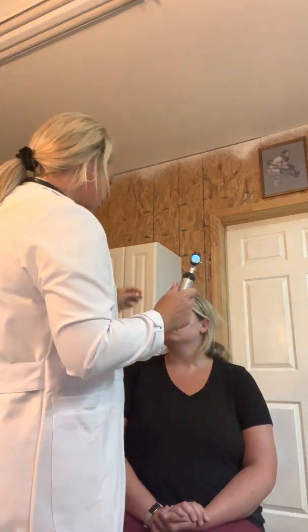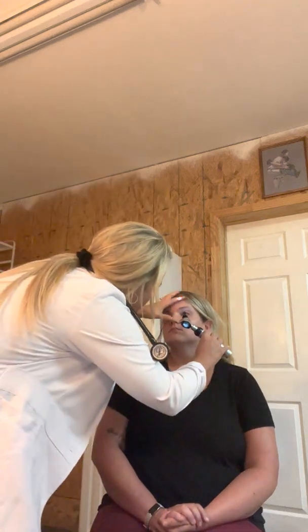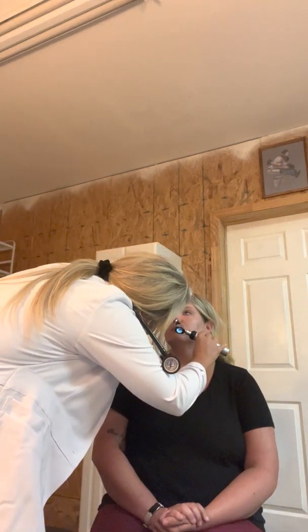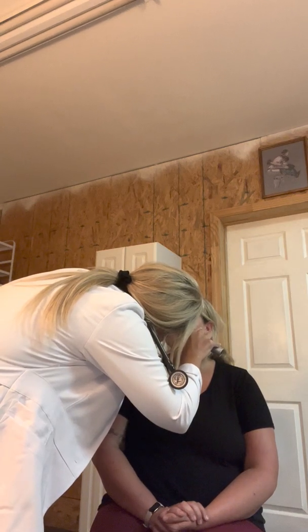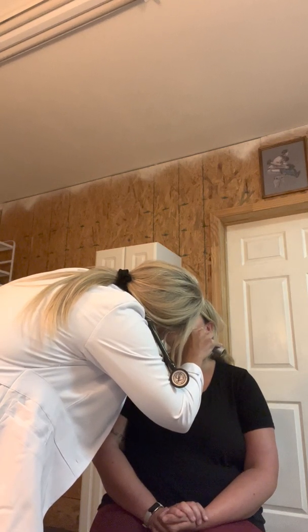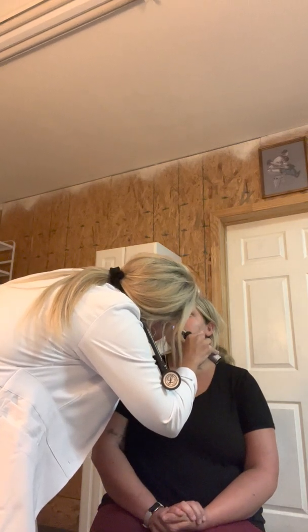And I'm just going to inspect the other side with my otoscope again using my dominant hand. I'm going to use this to hold your nose and support that. Again, this septum appears midline. No signs of trauma. The mucosa looks pink and moist. No polyps observed, no cyanosis.